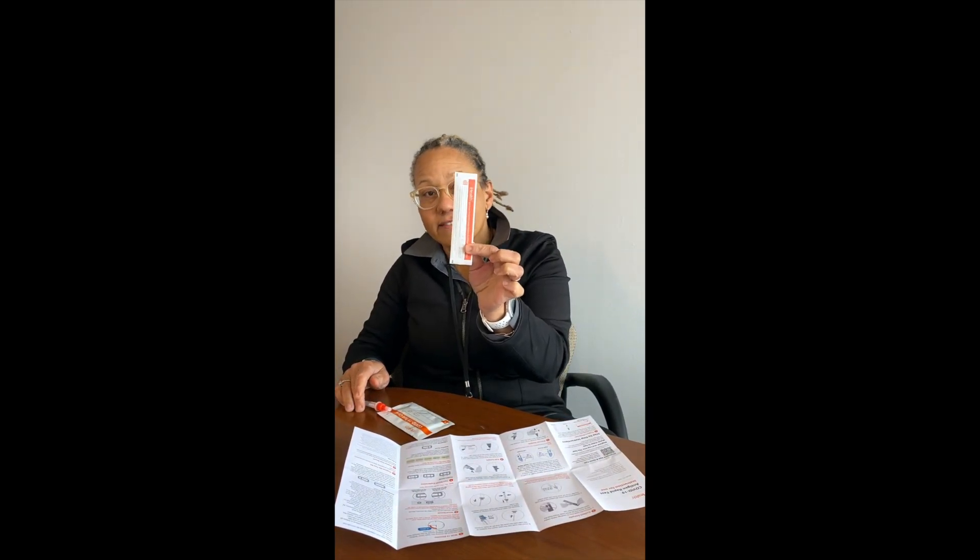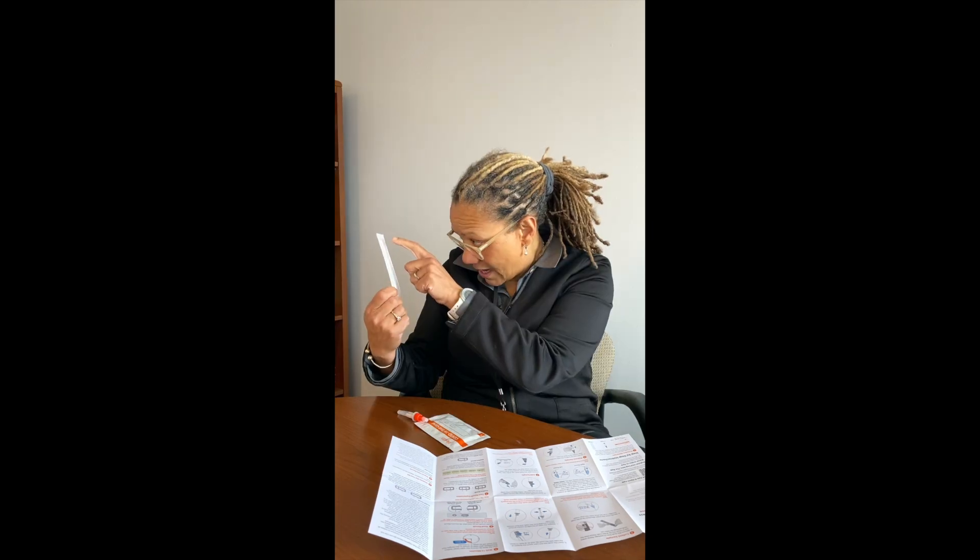The first step on the instructions says to collect the sample. To collect the sample, I'm going to take the long skinny package — it's called the specimen collection swab, which is just a fancy way of saying the q-tip. Opening this, you don't want to touch the top of the q-tip with your bare fingers. The cotton swab is at the top, so open from the other end very carefully.